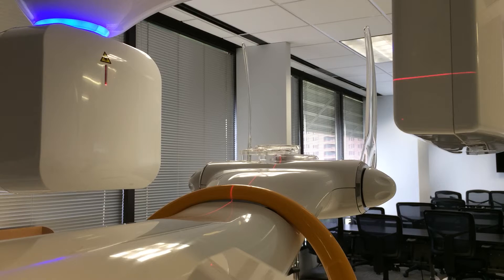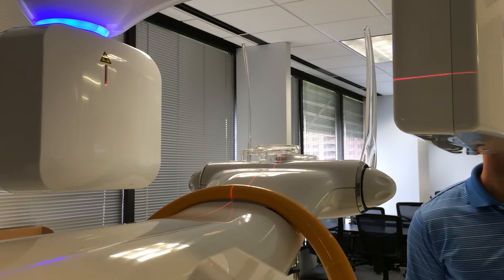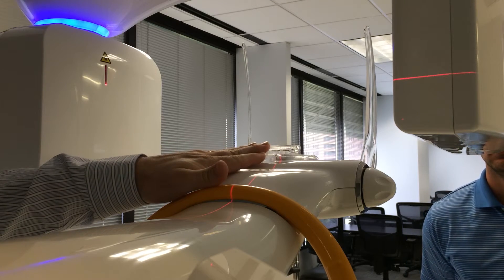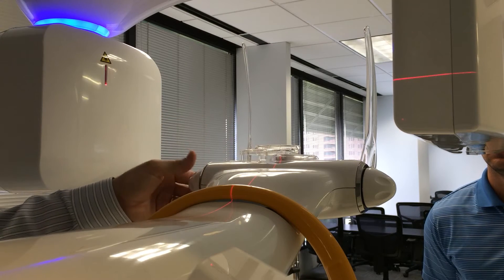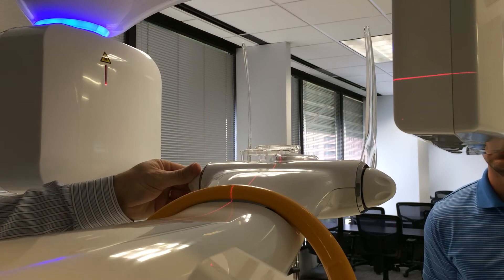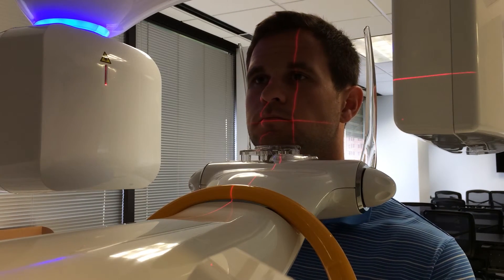Now we're going to position the patient for a three-dimensional TMJ acquisition — we're going to acquire the patient's left TM joint. As you can see, the chin rest is offset to the right so that the patient's left joint will be centered in the image, and I've opened the temple supports up all the way to give the patient room to get in. JP, please step forward and place your chin on the chin cup and use your hands underneath to hold on to the orange ring.